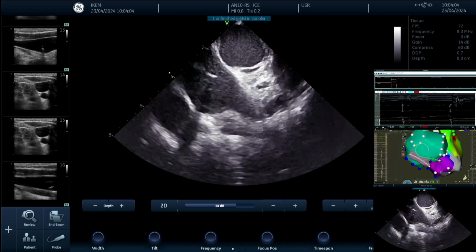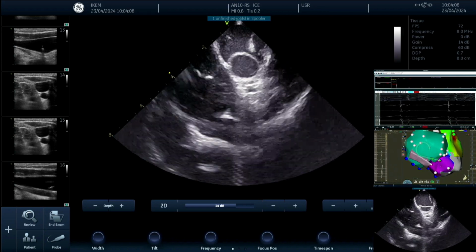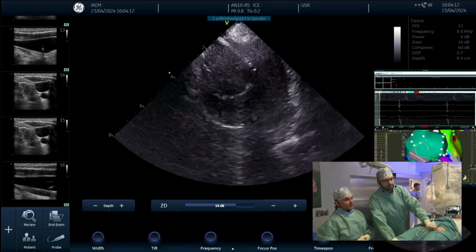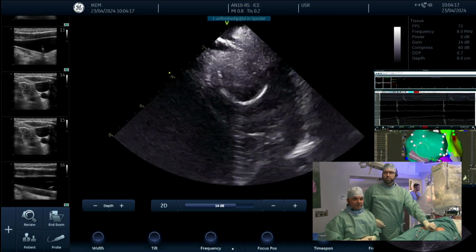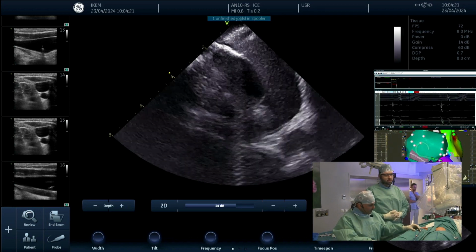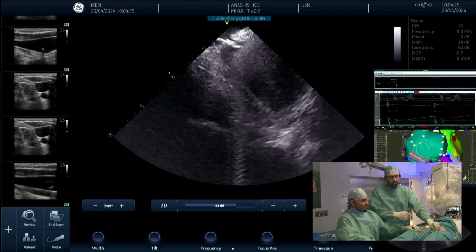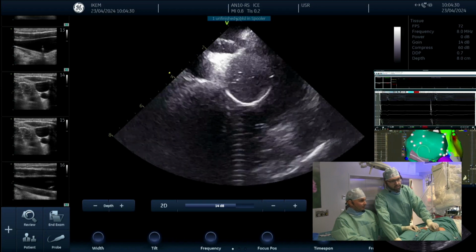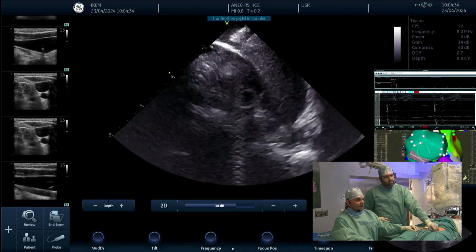Again, the appendage from the short axis. You can see the left veins, and also the left main appendage. And the ridge between the appendage and the left vein: we emphasized yesterday how important it is to display and properly manipulate any tool intended to do a PV isolation on the left side, because the left side is more anatomically difficult than the right side. Are you okay with the position? I think, yeah, it's good. Okay, let's ablate here, 35 watts.